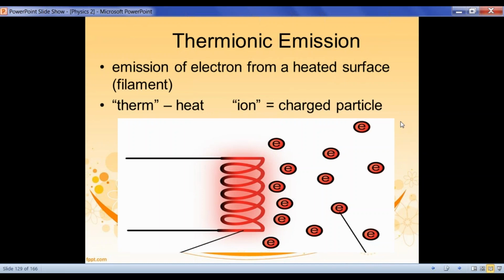Pero, sa kalaunan, dahil nag-iinit na po siya, dahil matagal siya naka-on, dahil mainit na po siya, dadami na po ang amount of electrons na kanyang mapuproduce, mas nagiging mas maliwanag ang ilaw ng bulb. Okay? I hope maintindihan po natin yun.